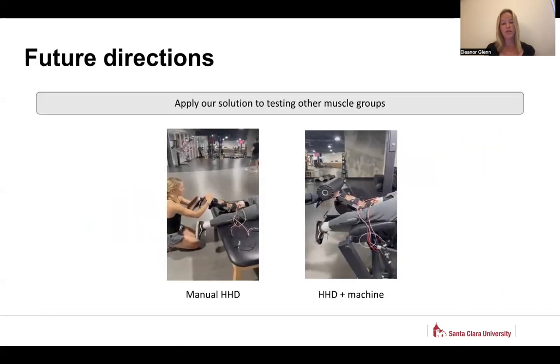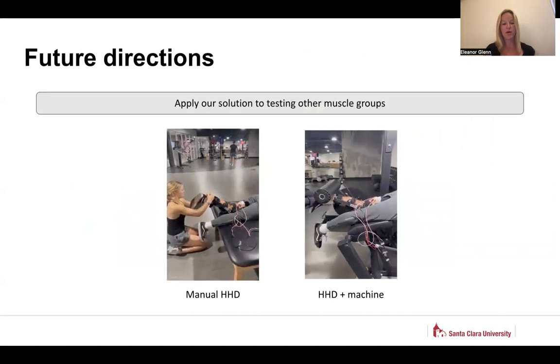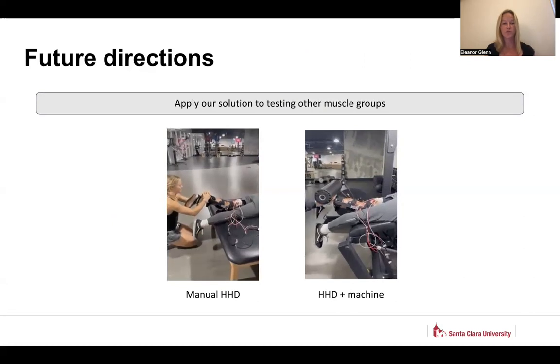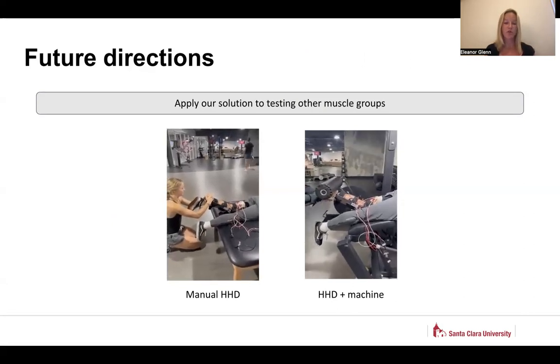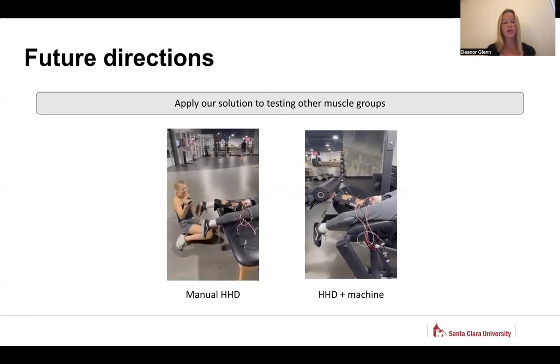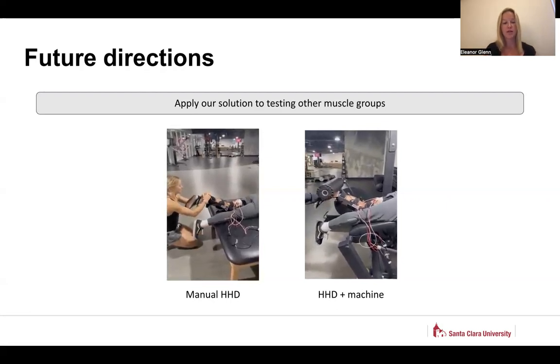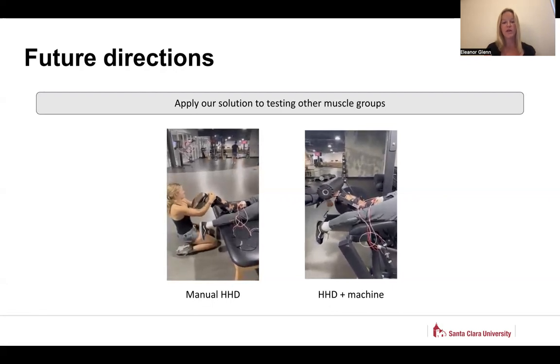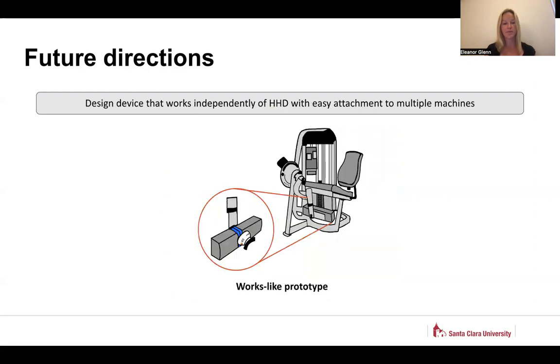In the future, we intend to integrate our improved protocol for a variety of exercises and target different muscle groups. The video on the left shows the manual test method for hamstring muscle strength. In the video on the right, you can see how the control and ease of the test increase by incorporating an exercise machine. We also want to build a device that can be easily attached to a common exercise machine found in the gym, allowing for a quicker setup.